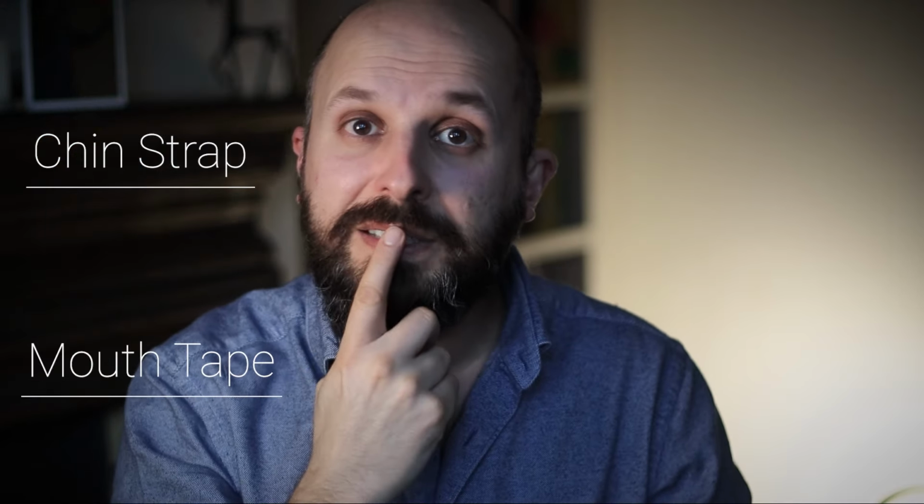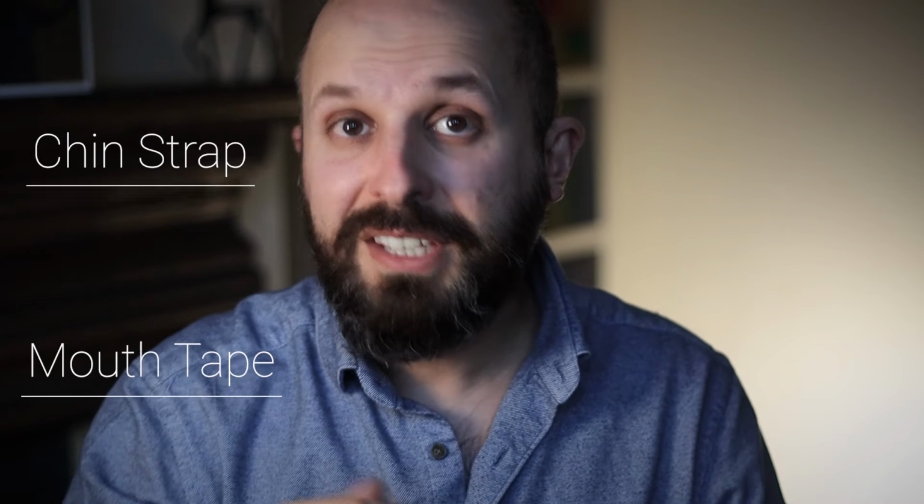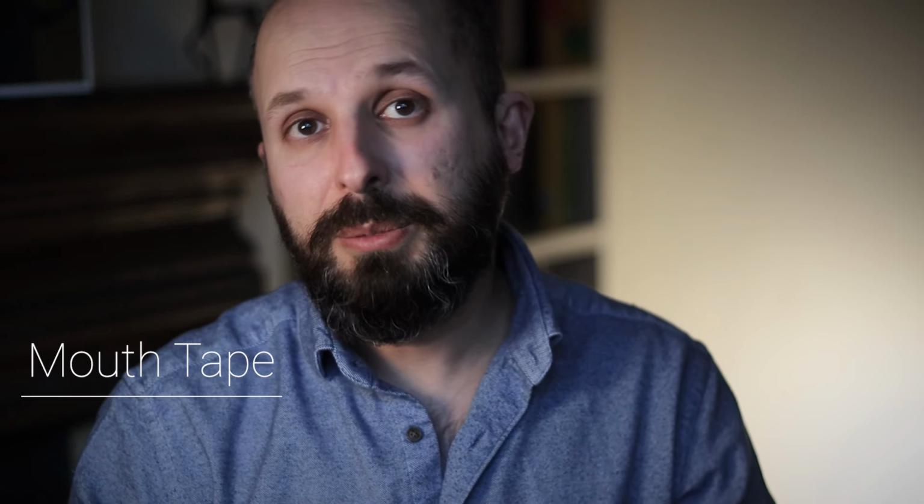Now, the idea behind these nasal dilators is that you're trying to open up the nasal passages so you can breathe preferentially through your nose. Even though you can now suddenly breathe through your nose, it doesn't mean that you'll magically switch over to nasal breathing at night. Some people just carry on breathing through their mouth even though they can breathe through their nose. So you need to train yourself to breathe through your nose again. In some people that means wearing a chin strap, like a rubber band or something that keeps your mouth closed. We can use mouth tape to keep your mouth closed. And once your mouth is closed, a lot of people stop snoring because of that.